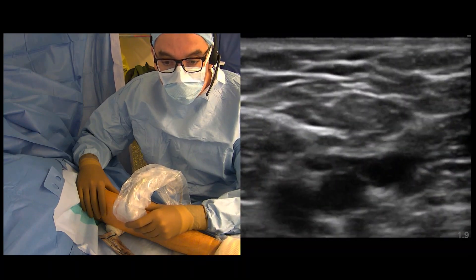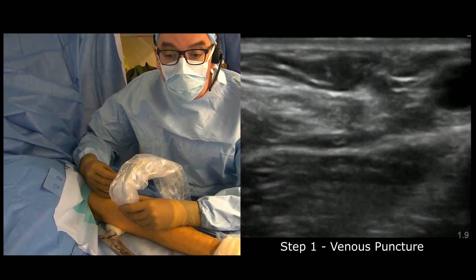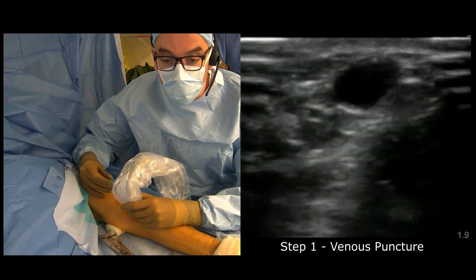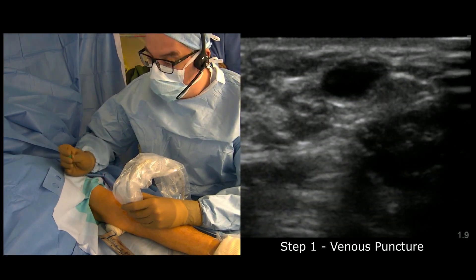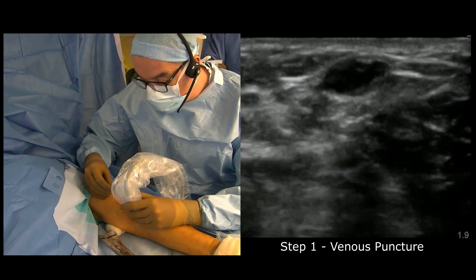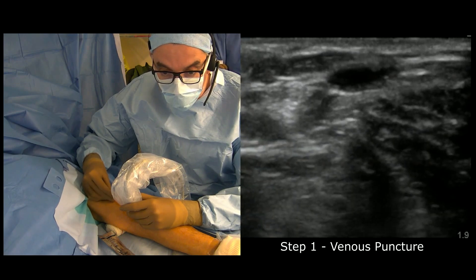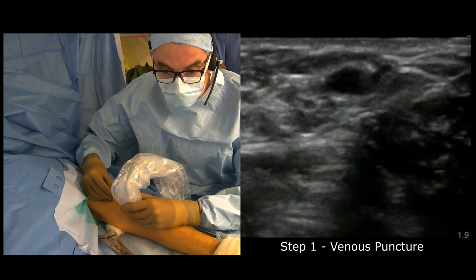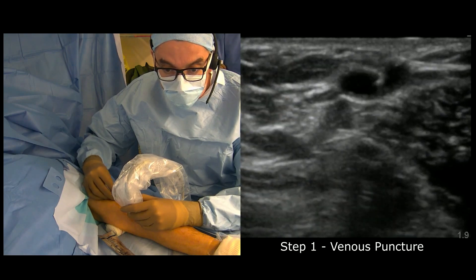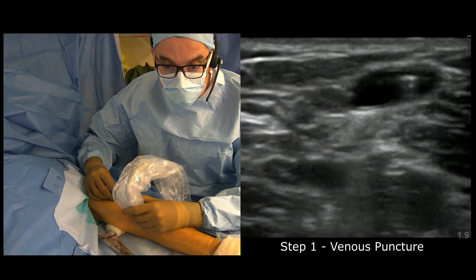This is the anatomical configuration that we're taking advantage of. I'm going to perform puncture of the cephalic vein a bit north from the takeoff of the deep communicating vein.